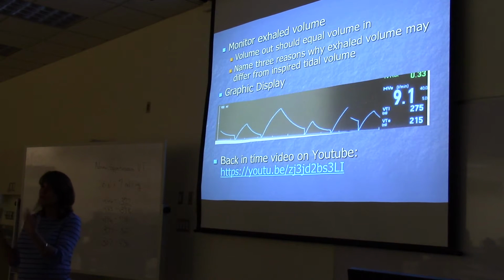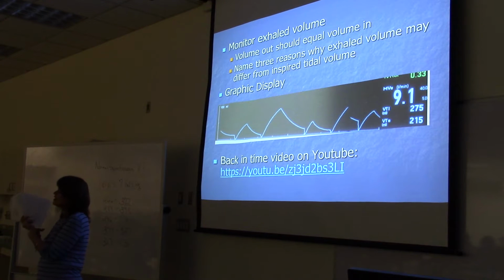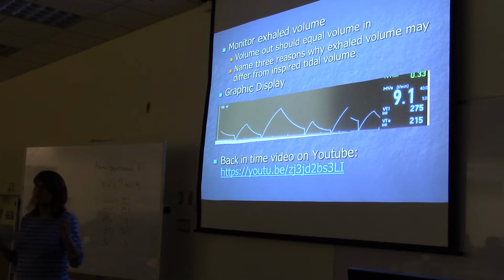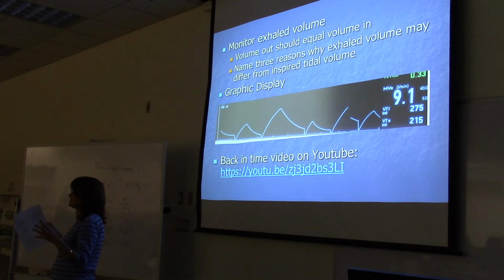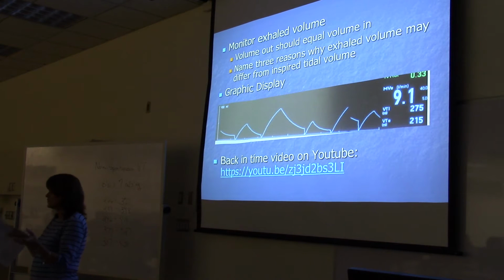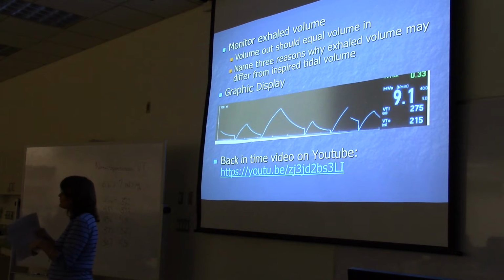The air comes out of the piping system really cold, goes through the ventilator, goes to the patient, and the patient's body warms it up, saturates it with water vapor, and now the volume has expanded. Usually about 50 mLs for every 500 mL tidal volume.